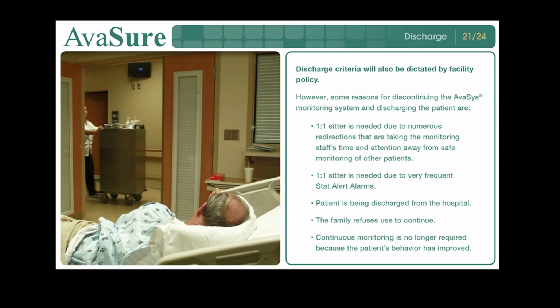Discharge criteria will also be dictated by facility policy. However, some reasons for discontinuing the AvaSys monitoring system and discharging the patient are: one-to-one sitter is needed due to numerous redirections that are taking the monitoring staff's time and attention away from safe monitoring of other patients. One-to-one sitter is needed due to very frequent Stat Alert alarms.